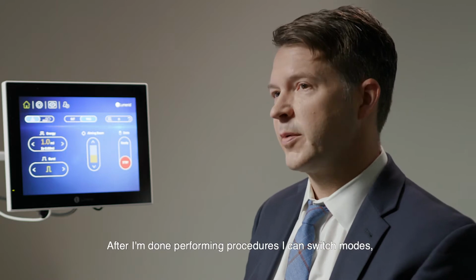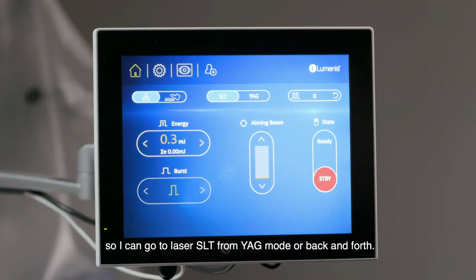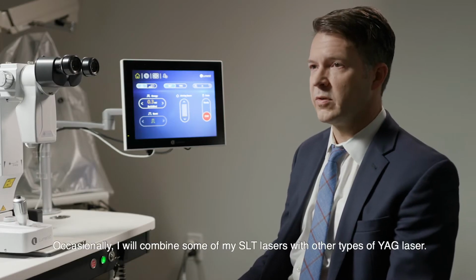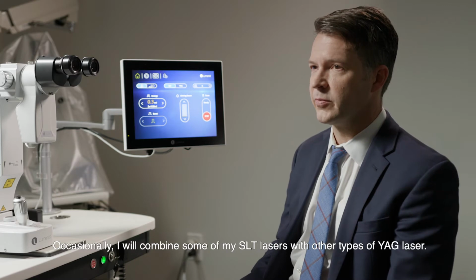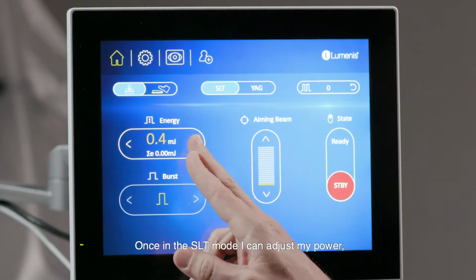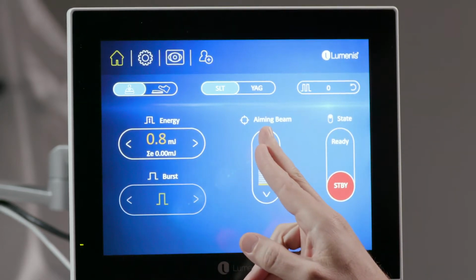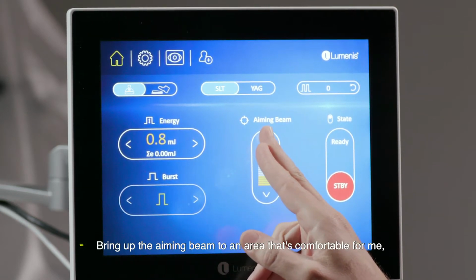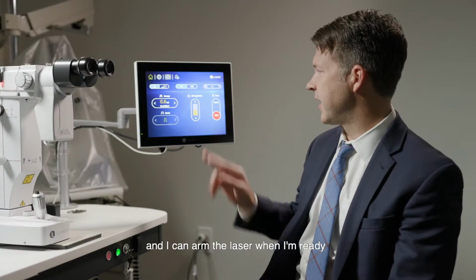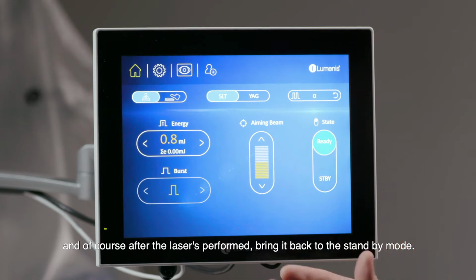After I'm done performing procedures, I can switch modes. So I could go to laser, SLT, from YAG mode or back and forth. And occasionally I will combine some of my SLT lasers with other types of YAG laser. Once in the SLT mode, I can adjust my power, usually between 0.8 and 1 millijoules for me, bring up the aiming beam to an area that's comfortable for me, and I can arm the laser when I'm ready, and then of course, after the laser is performed, bring it back to the standby mode.